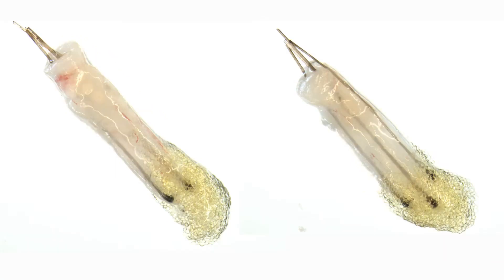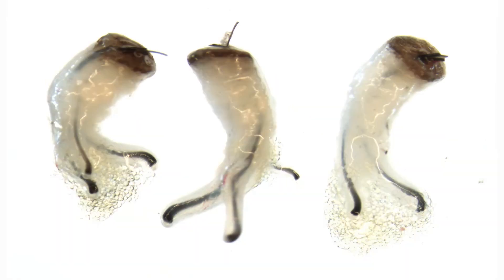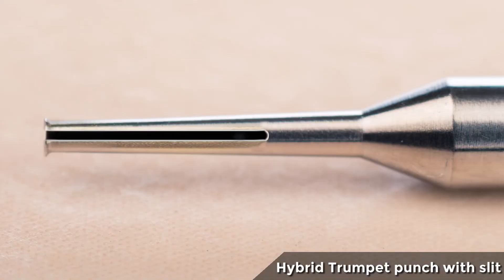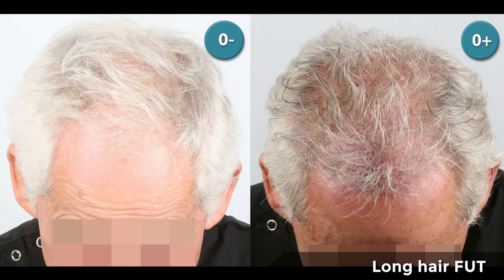With this technique improvement, we'll soon be able to claim results perfectly similar to those obtained with the FUT technique. This is the beginning of the fascinating adventure of the hybrid trumpet punch and its future improvements. Other ideas are already underway, such as the adaptation of the slit invented by Dr. Bonaventura and Dr. Erdogan in order to perform FUE extractions on long hair. Thank you for your attention.